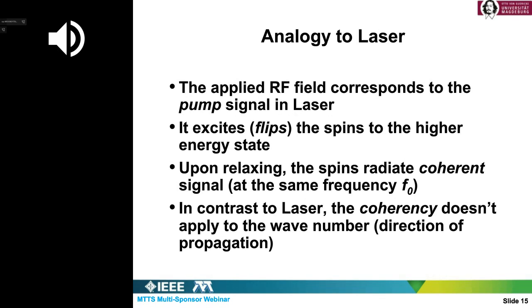This is a simple analogy to laser. For those of you who studied laser, you have nearly the same principle. In thermal equilibrium you have more lower energy particles than higher energy. You first pump energy in order to invert this population, and then you stop the pump.